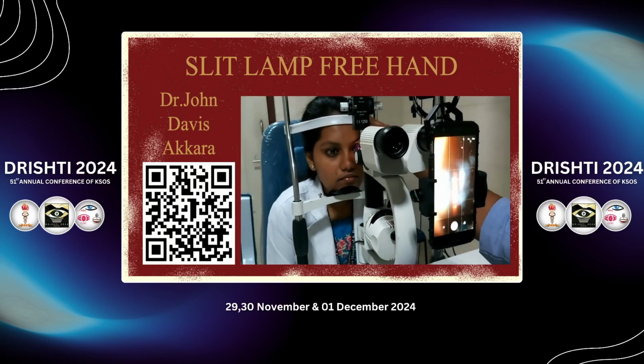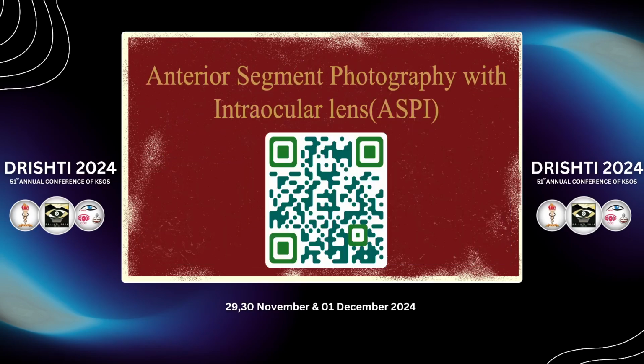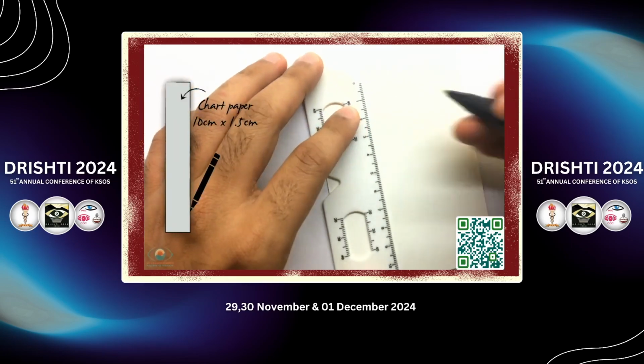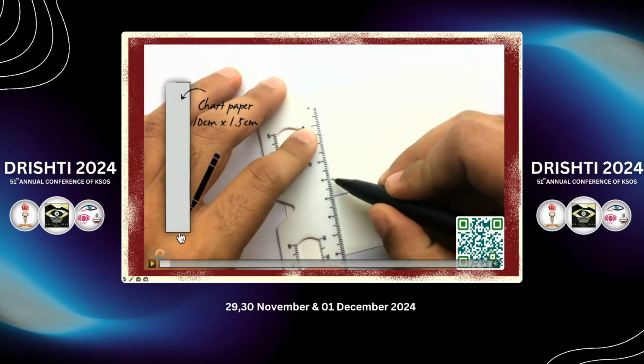This is a little sped up, so you see the circle of illumination, and this is undilated fundus examination. So you can see the disc undilated and take a photograph of the optic disc also like this. If you use the hand directly, you can take photographs, but if you want to take fundus photographs, gonio, or take a video, then you can use the adapter. Initially it will take a little bit of getting used to, but once you get used to it, it's very quick, like within seconds you can take photographs.